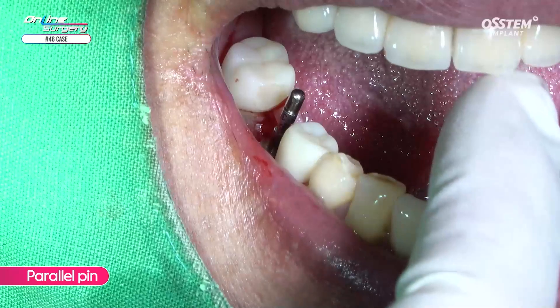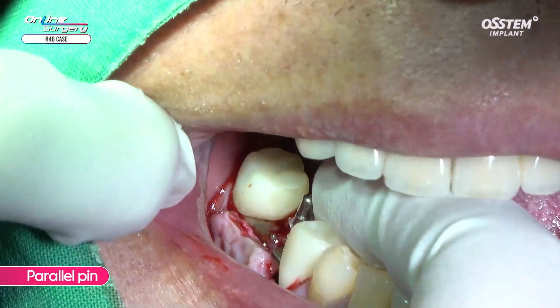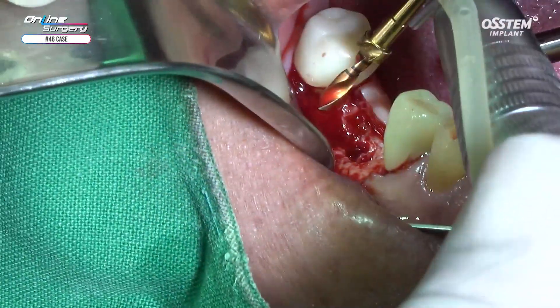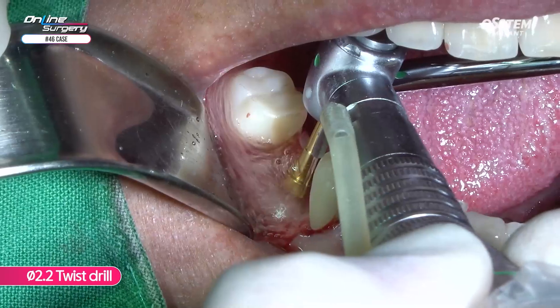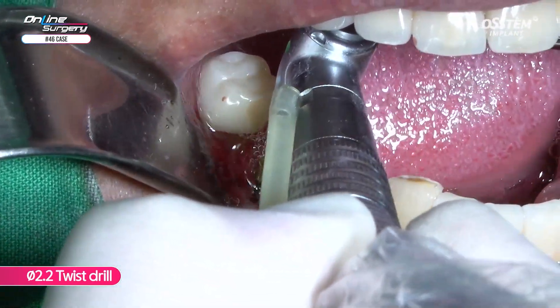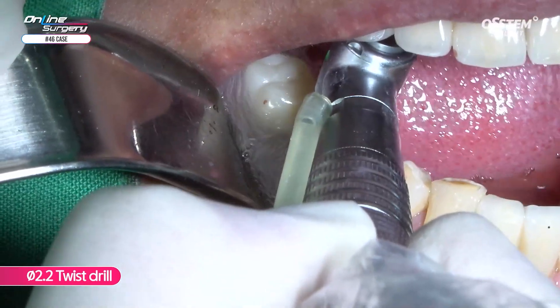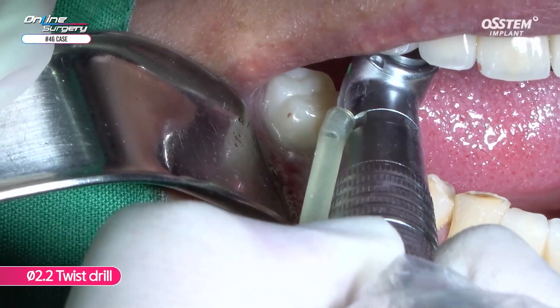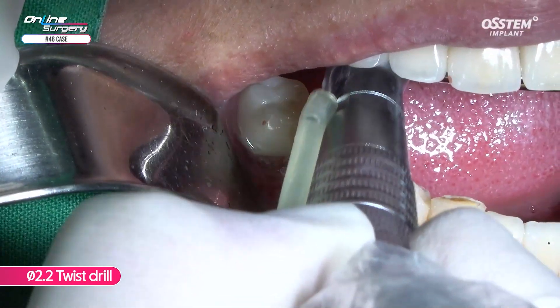천천히 다물어 보세요. (Please close slowly.) 아 한번 걸리셨걸요. (Ah, it caught once.)